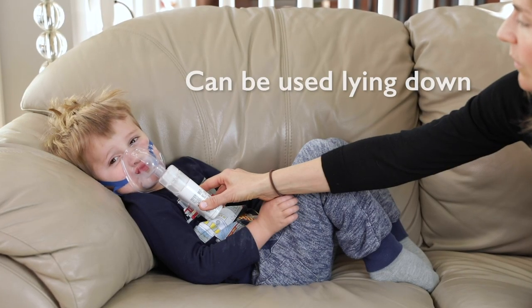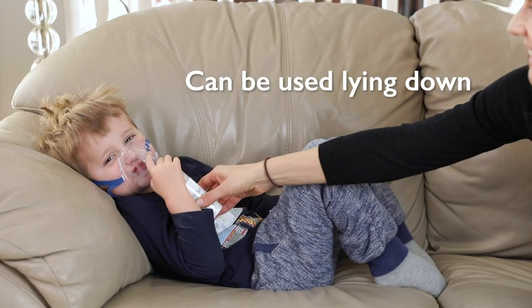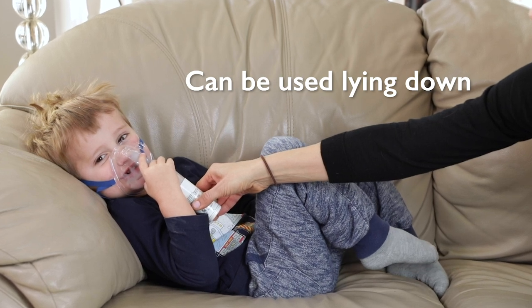Another big pro of this product is that you can use it at any angle, even when lying down. Most handheld units need to be held at a 45 degree angle, but this one is unique in that you can use it while practically vertical.